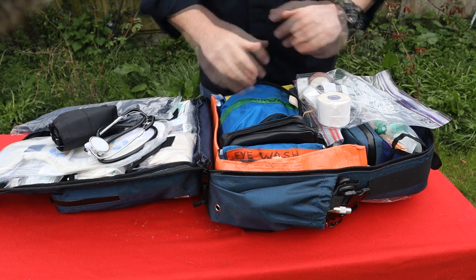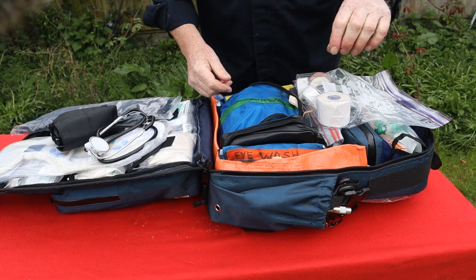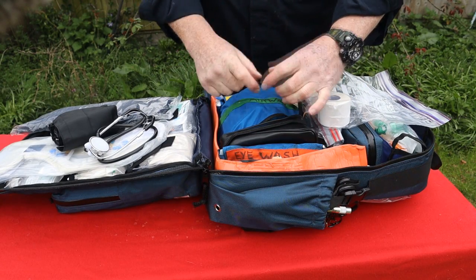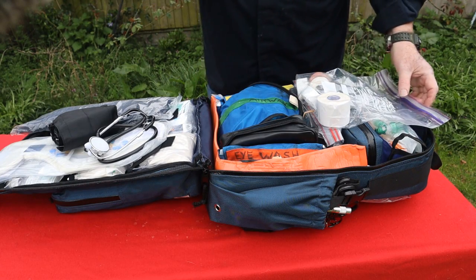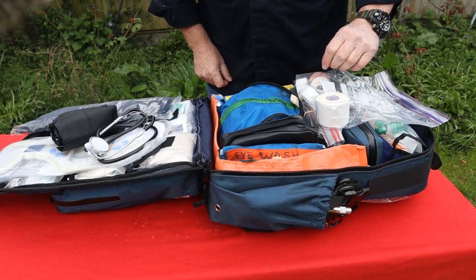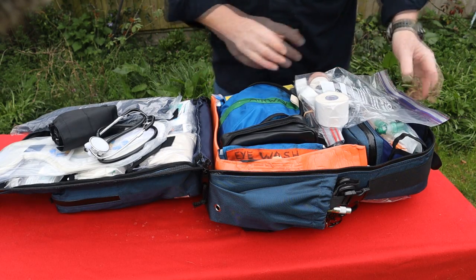If you do get IV access, it's imperative we don't lose it in the field. So once I used to get IV access, I pull off a couple of bits of tape and I put a 4-inch square piece of tape with a hole cut in it so I can get to the drug port, and that just ensured that IV didn't come out. So in this bag I've got paper tape, micropore, 2-inch plaster. I've got normal kind of plaster tape, but whatever I need is kind of in that bag really.